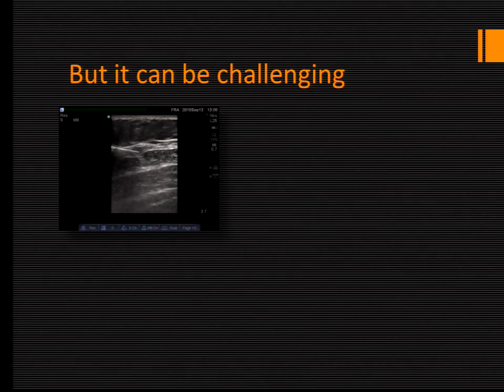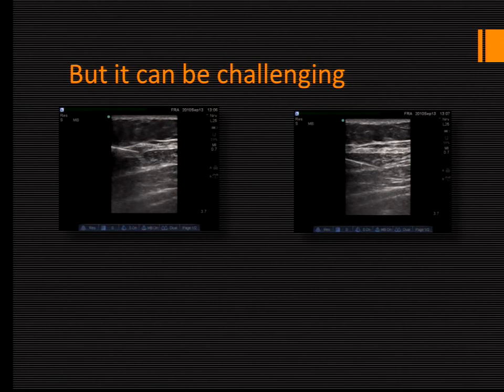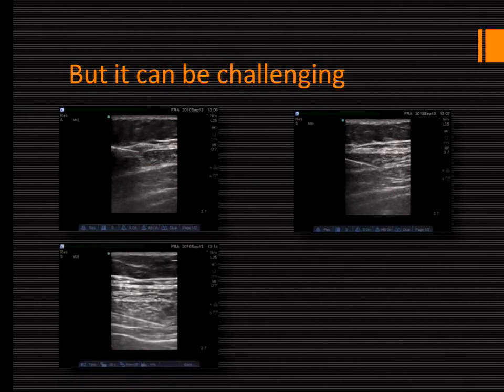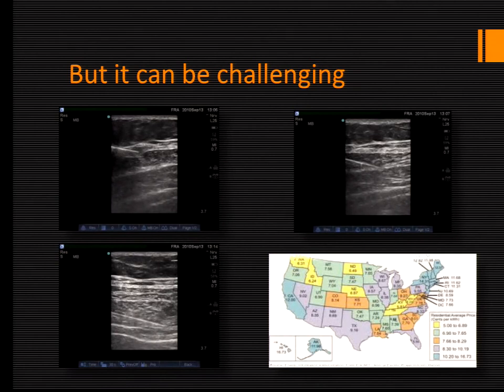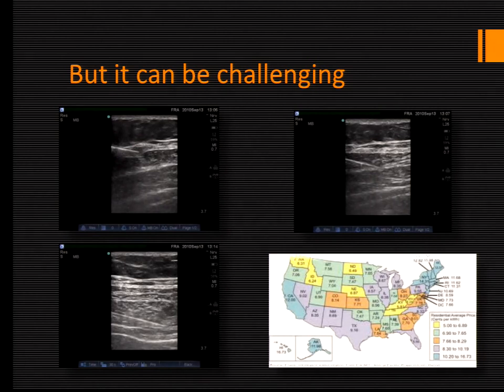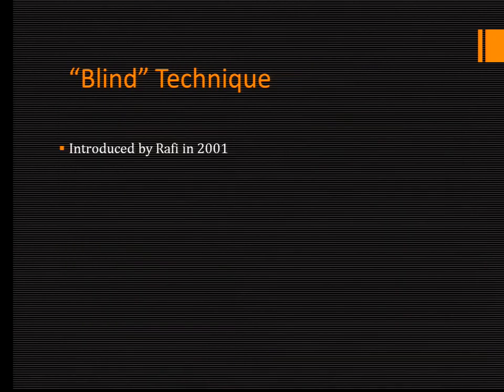Here we're trying to do a TAP — you can check the time. A minute later we arrive at a first plane, and several minutes later we finally arrive to the correct plane. As you can see by the projection of the needle, it's like coming from Washington State all the way to Chicago — but eventually getting to the plane. In terms of ultrasound technique, pretty straightforward. We will go through some of the issues, but arriving to that plane is a straightforward thing.